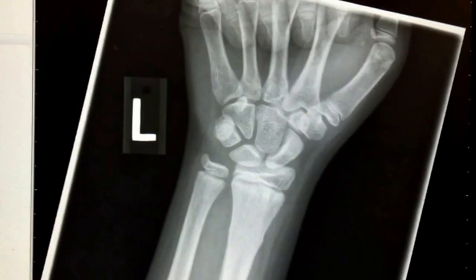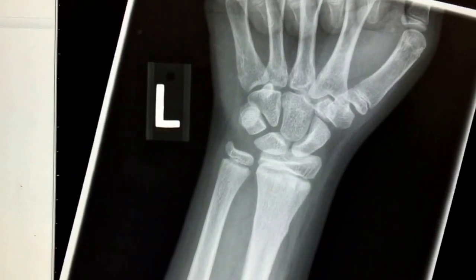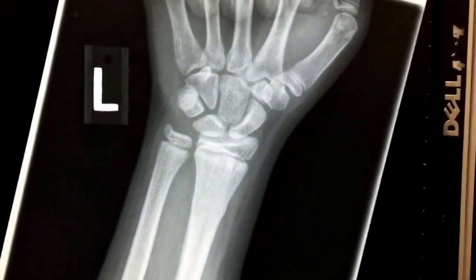This is a very simple X-ray but it does show things that we should all know. Basically it's a young child — I know that because the bones are not fused at the epiphysis.